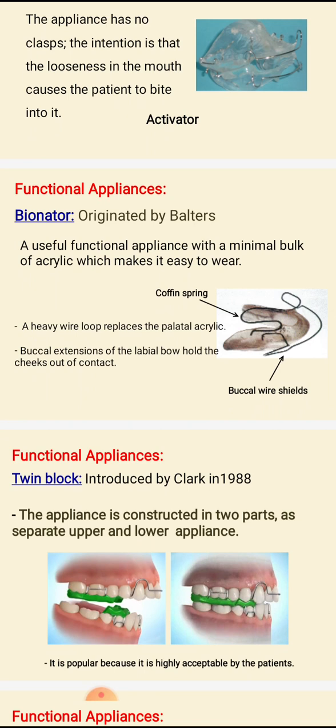We have also buccal extensions, which form buccal wire shields. These buccal wire shields hold the cheeks out of contact with the teeth, and this also helps in expansion.